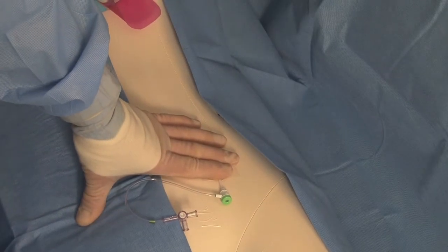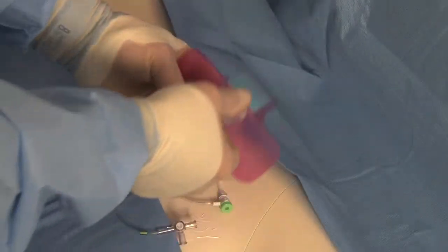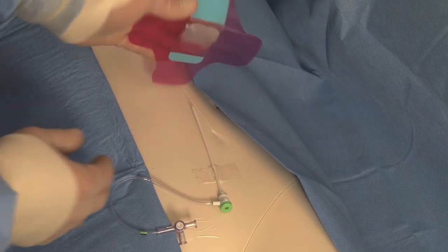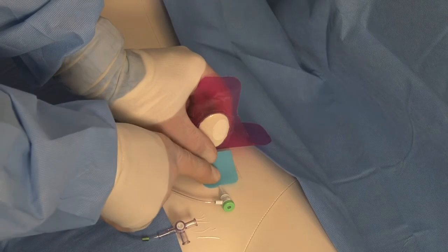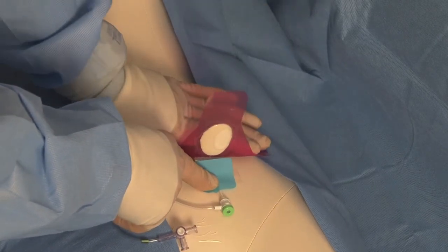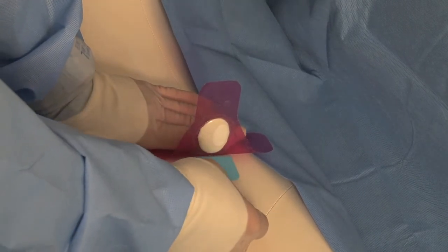Once the procedure has been completed, the femoral drape would be removed from the patient, exposing the access site with the sheath still in place. You would remove the adhesive backing from the back of the AngioPatch dressing, exposing adhesive. It would then be applied to the patient, locating the chitosan closure pad directly over the center of the access site. You would press it into place, securing the adhesive. At that point, you are ready to remove the sheath and begin hemostasis.